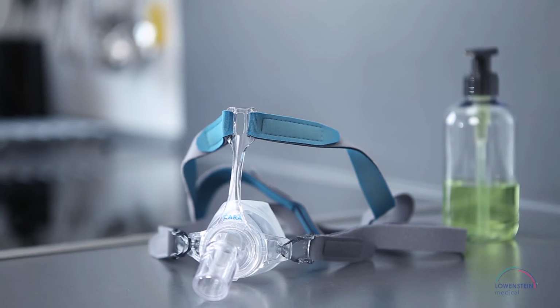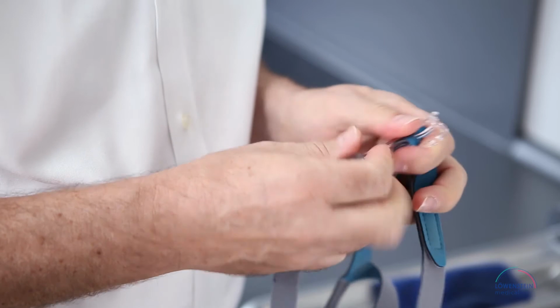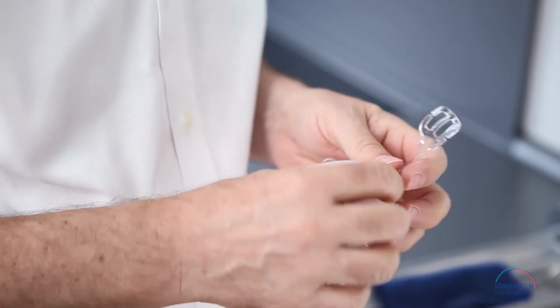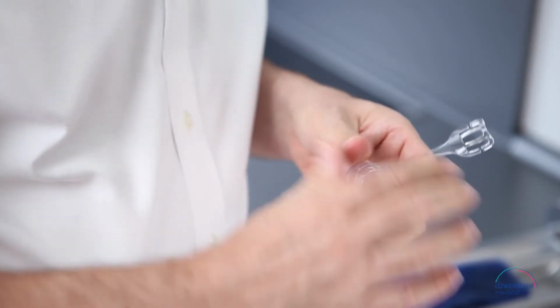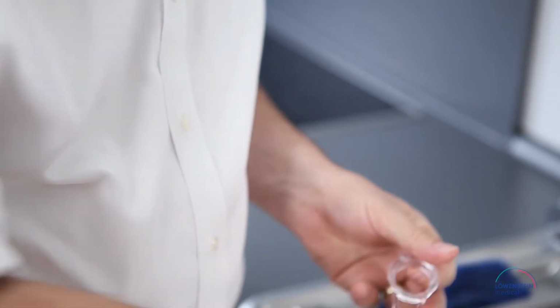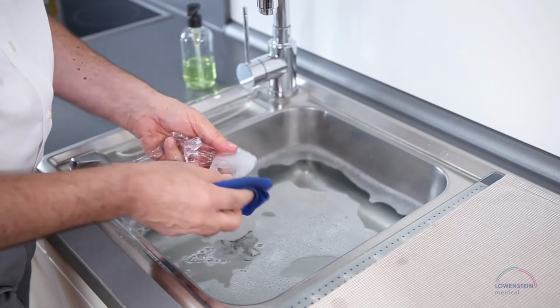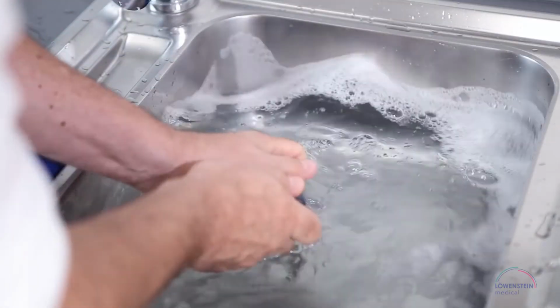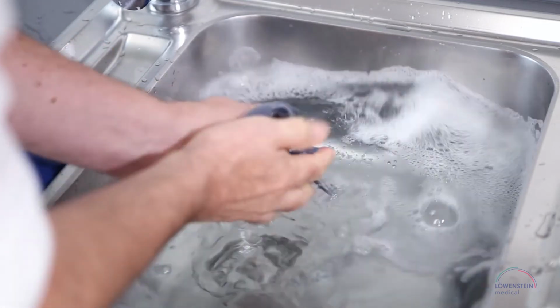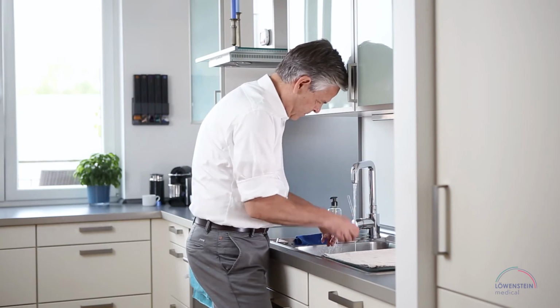We recommend that you clean CARA every day. To do so, take apart the headgear, mask cushion, and all plastic parts. Wash all the parts separately in warm water with a mild detergent. Cleaning the headgear just once a week is sufficient. Rinse all parts thoroughly with clear running water.